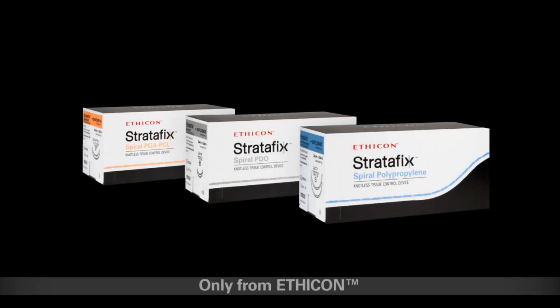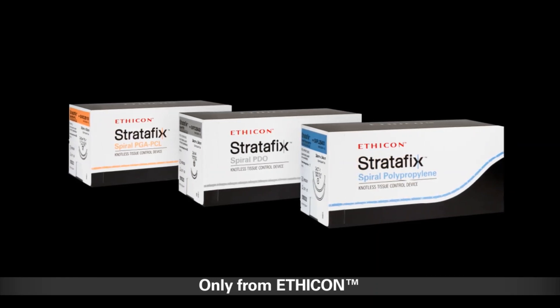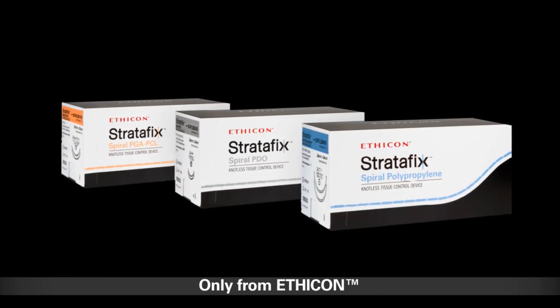Stratafix spiral knotless tissue control device — the next evolution in wound closure and tissue repair. Delivered only by Ethicon.